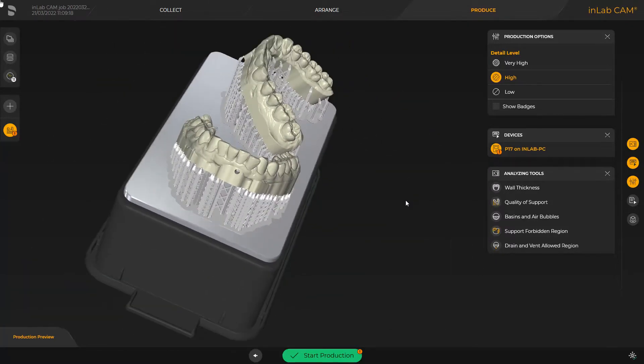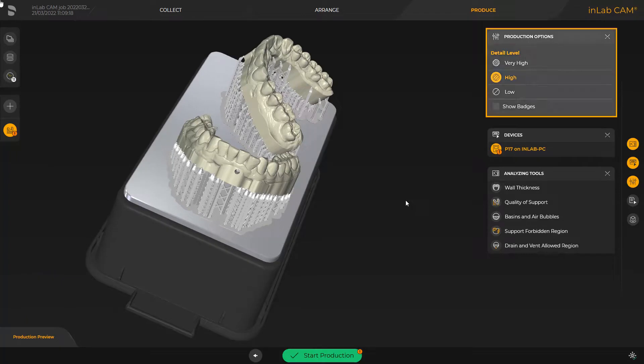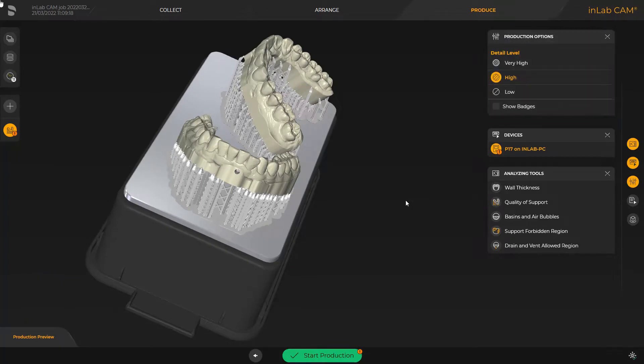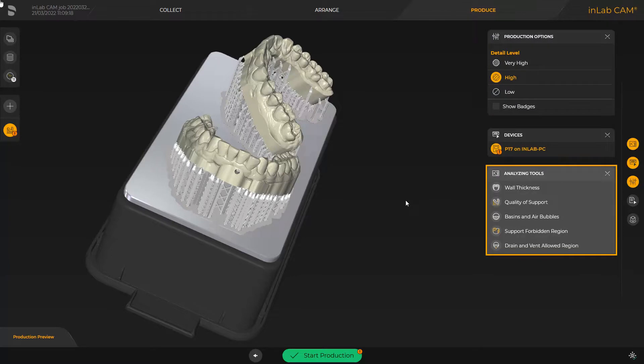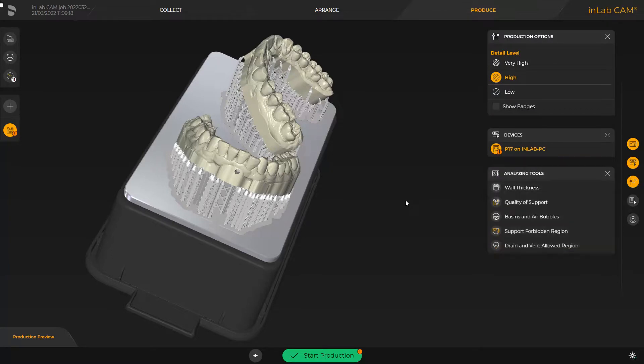In the window under production options, you can finally modify the detail level and analyze the print object with the analyzing tools. To start printing, we tap the green area labeled start production.